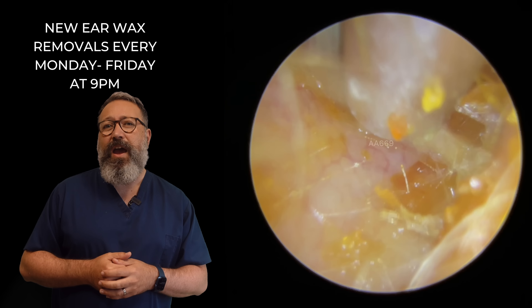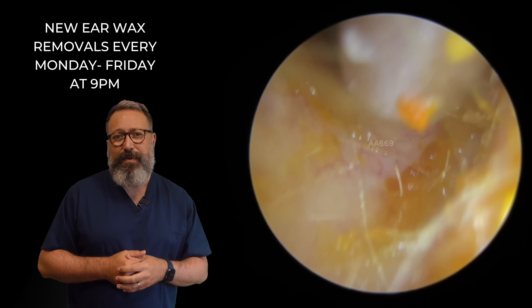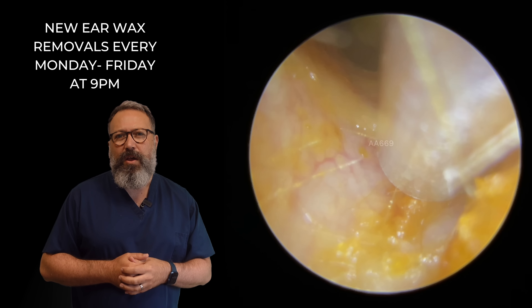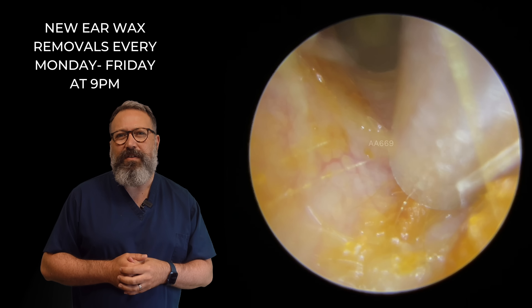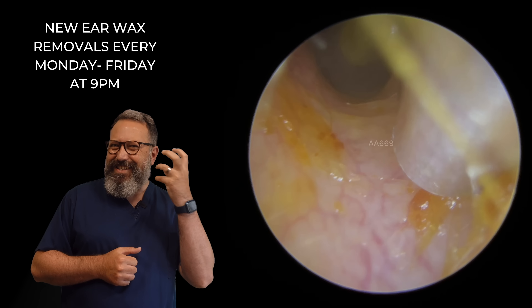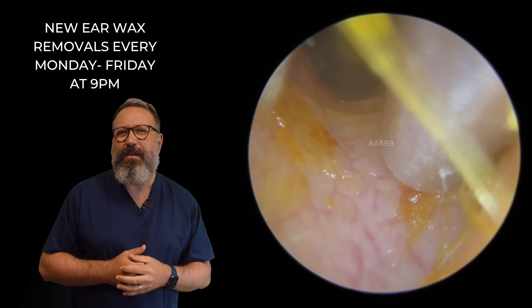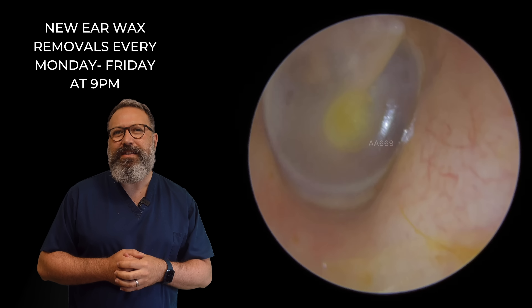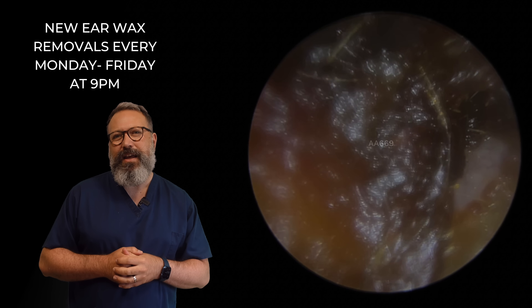Now this patient also has very, very sensitive ear canals. So they're always a little bit more conscious about taking these thinner pieces off the canal wall, just because this patient does tend to feel not so much pain, but will express that there's a little bit of discomfort there as it starts to come away. Just got this last little bit. There we go. That's looking lovely. There's the eardrum there looking nice and healthy.